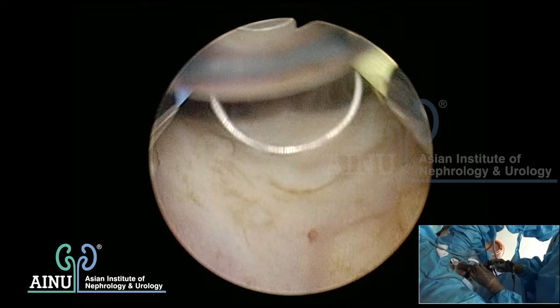Most of the time the prostatic fossa looks very open with a distended bladder. You should always assess the resection only in a half-distended bladder, not fully distended. At this point, I feel I have done a fairly decent job and there is hardly any prostatic tissue left to resect - only capsular tissue. I don't want to do any more resection especially at the top. I preserved all the sphincter and smooth muscle with the mucosal lining over the sphincter. Don't give a tendency to coagulate vessels near the sphincter as that will damage muscle fibers below.